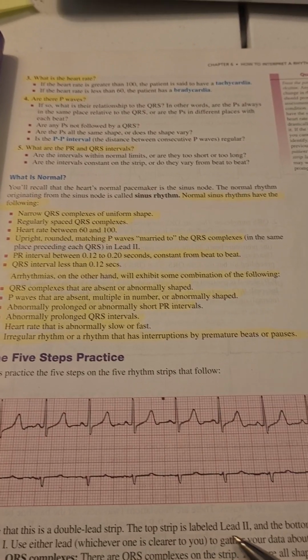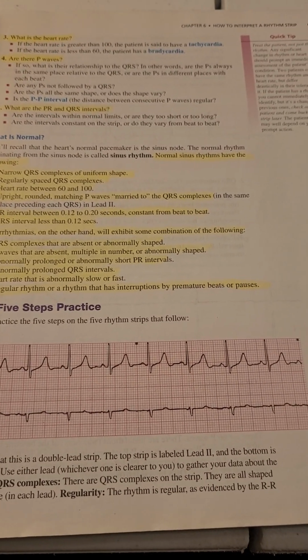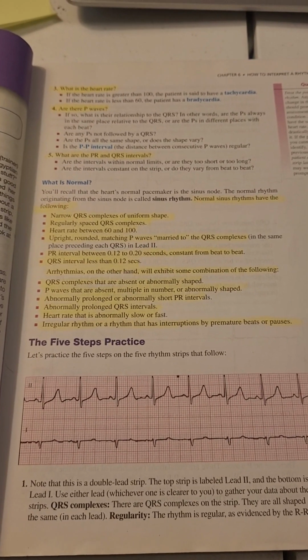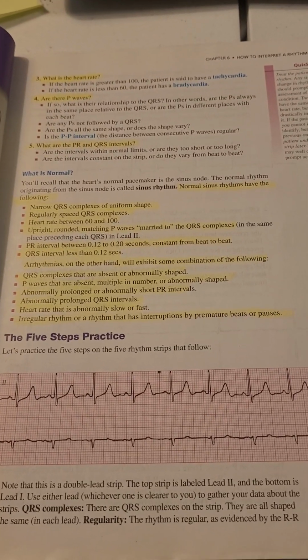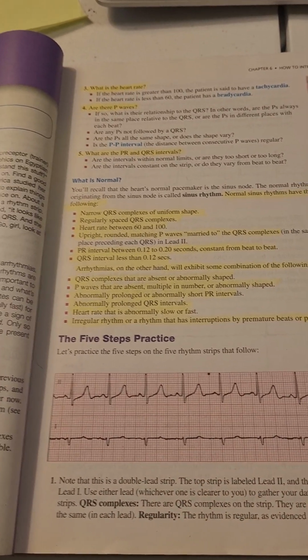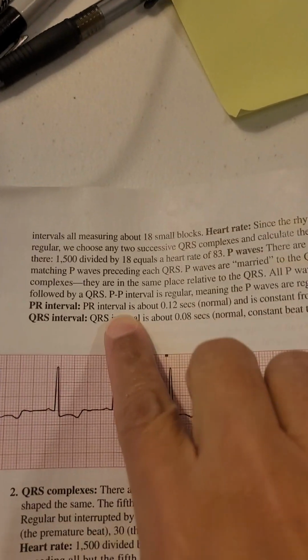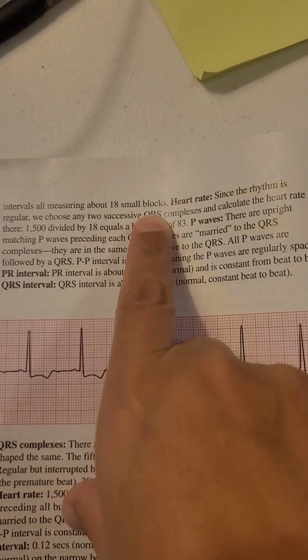The top strip is labeled lead 2 and the bottom is lead 1. There are QRS complexes on the strip, and they're all the same shape in each lead. Regularity: it's regular, it's marching out, and it's the same time every time, R by R. The intervals all measure about 18 small blocks.